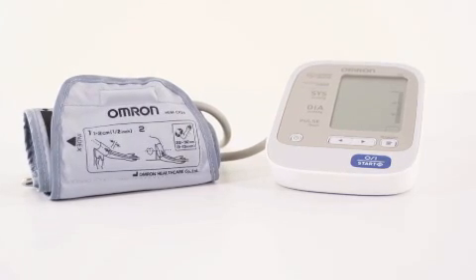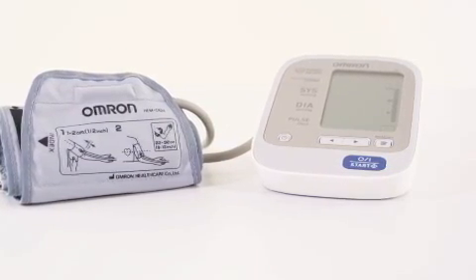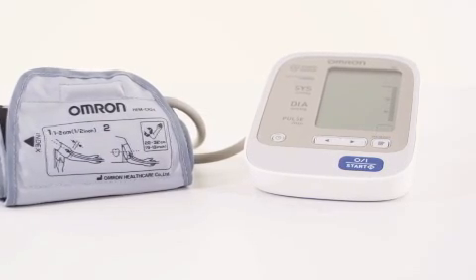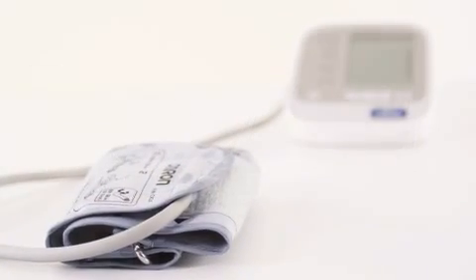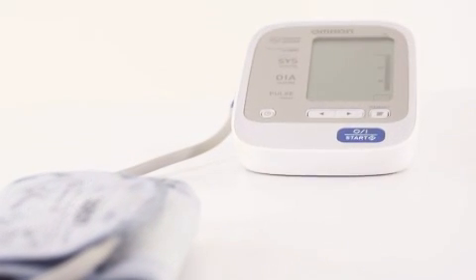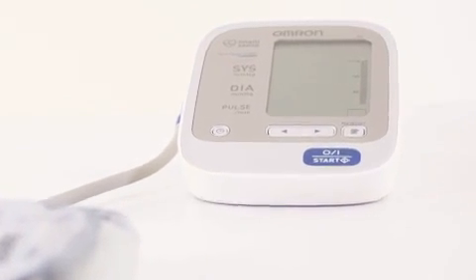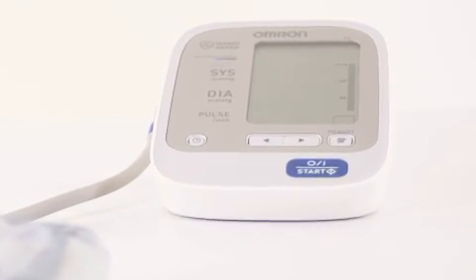The Omron M6 is a compact, fully automatic blood pressure monitor for the easy and fast measurement of your blood pressure and pulse rate. This state-of-the-art monitor uses innovative IntelliSense technology to ensure, amongst other things, comfortable and controlled cuff inflation and precise measurements.